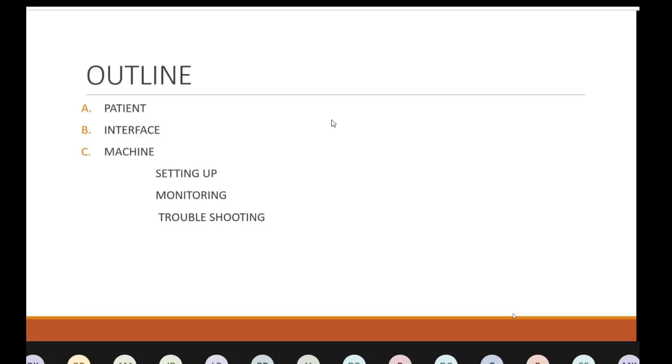Your mechanical ventilator does not use that much; it may use up to a maximum of 20-25 liters per minute. The flow that comes out of an intubated mechanical ventilator is not much greater than 20-25 liters per minute. Usually it is 15 liters per minute. But when you have a leak with NIV, using non-invasive ventilation with a mechanical ventilator, the peak flow can go as high as 120 liters per minute. In fact, we have seen peak flows of more than 150 liters per minute. So this much oxygen is actually leaking out.